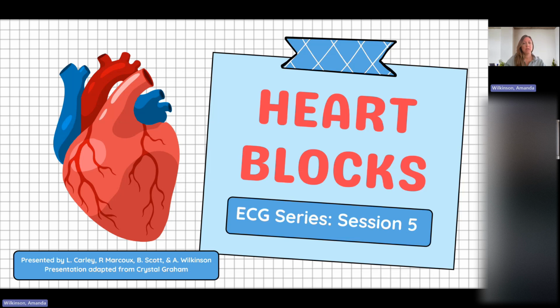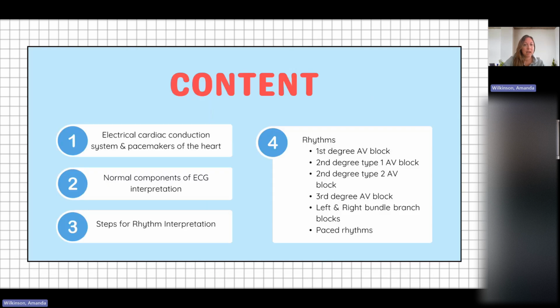Okay, so today we are doing heart blocks, which is probably one of my favorite topics in this series because people are a little intimidated by it, but actually when you break it down, it's not so bad. So that's why I think I like it.